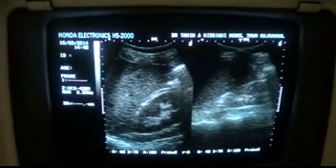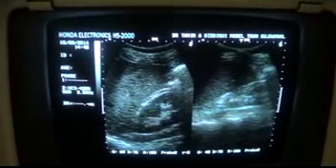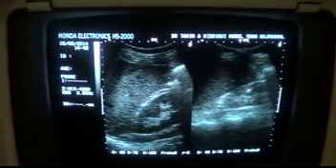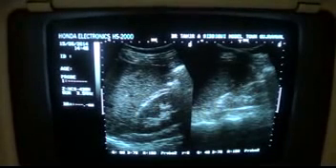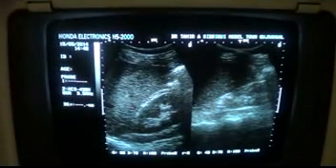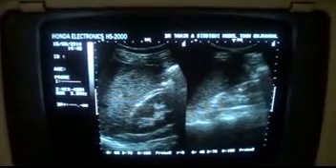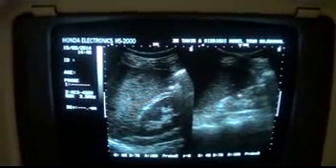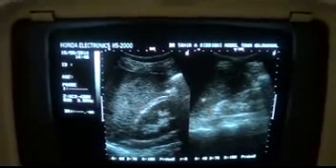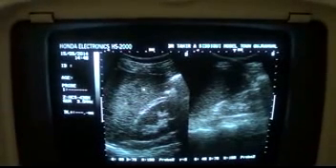The central sinus echo-complex is muffled, and the echogenicity of the parenchyma is raised diffusely throughout as compared to the normal kidney. See? And if you compare it with the spleen, then the echogenicity of the kidney has gone much above that of the spleen adjacent to it, as well as the normal liver.